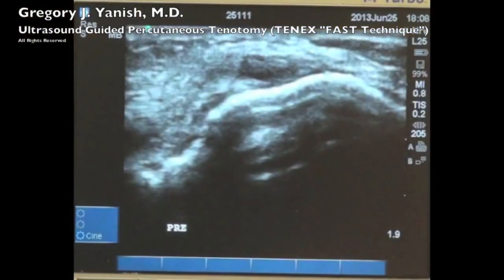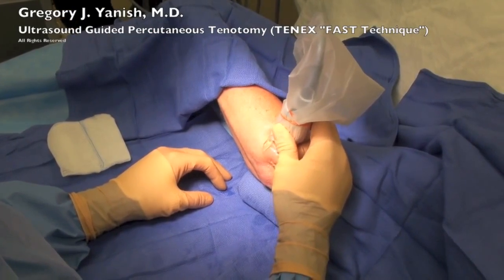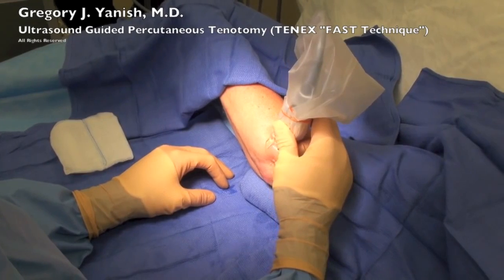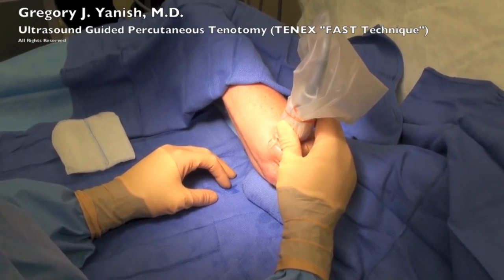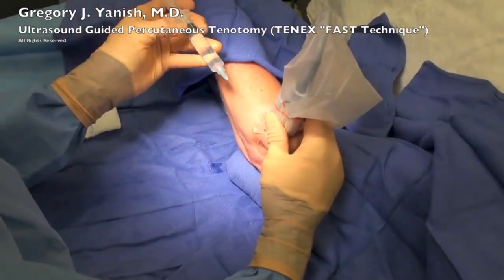Here's the ultrasound image that I'm visualizing. You'll see a bright white line in the middle of the screen, and that's actually the bone or the lateral epicondyle. Immediately above it, which will be marked with an arrow, is the tear of the common extensor origin. This black area is actually the tear or the injury to the tendon that will be removed during this procedure. I carefully scan this entire area, really getting a good feel for the tear. Again, here's another picture. This is the tear seen above the bone in the common extensor origin.